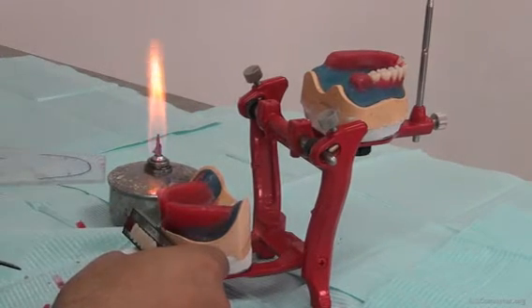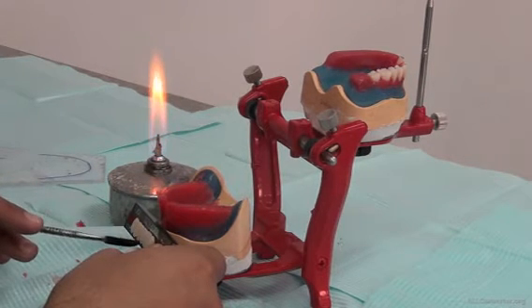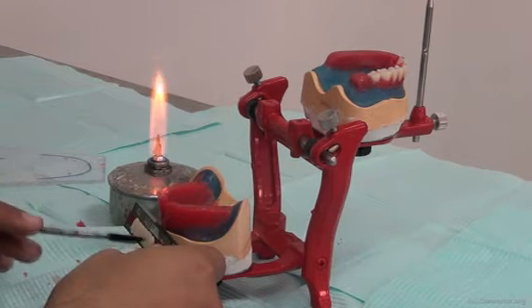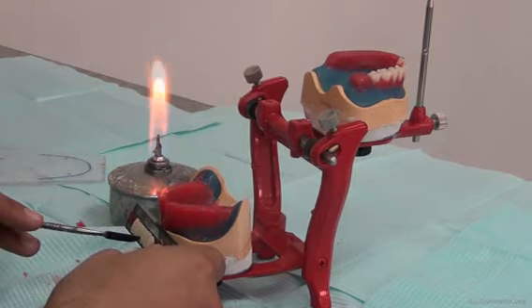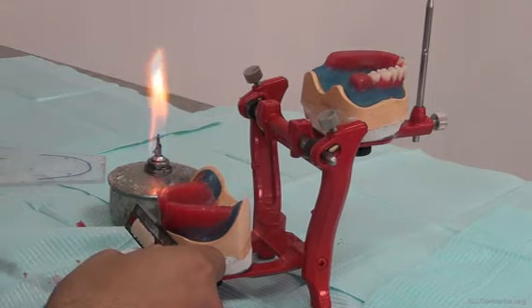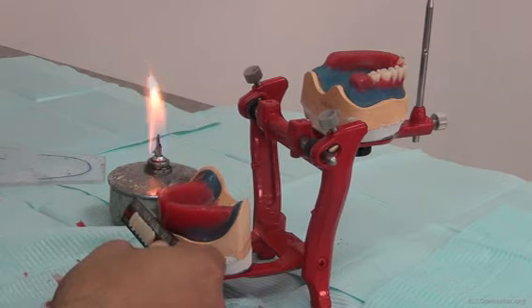So we're opening the space for the first lower incisor. For the setting of the lower, make sure that you don't mix teeth together because they look very similar. The midline on the set of teeth that you have is the midline where teeth are set to the right or to the left of it. So make sure you do not mix teeth up, because lower central incisors and lateral incisors are very close in morphology.